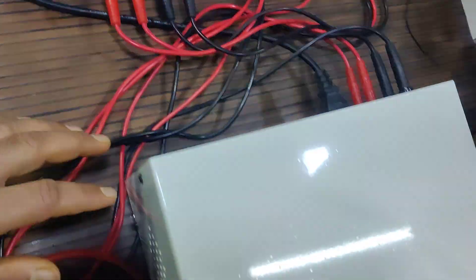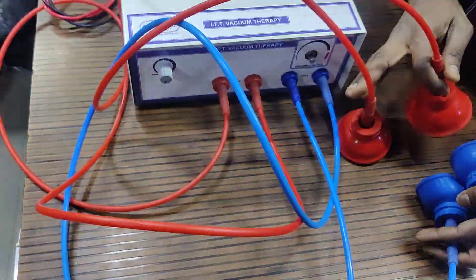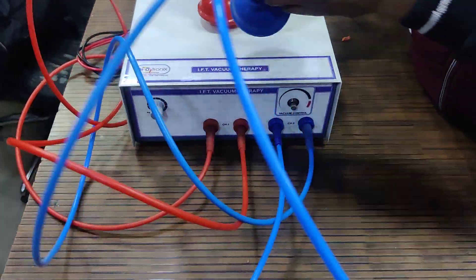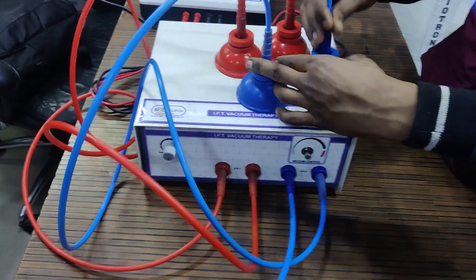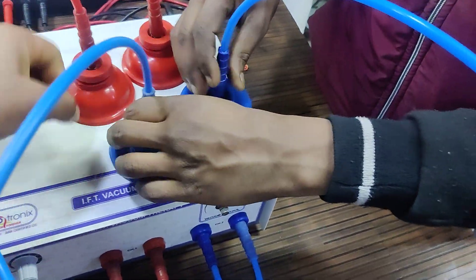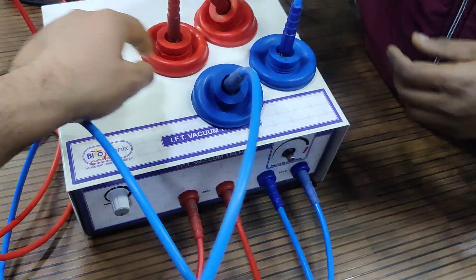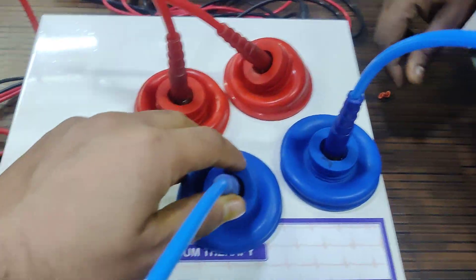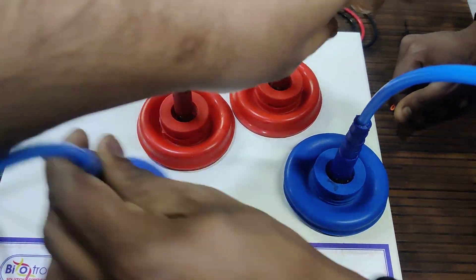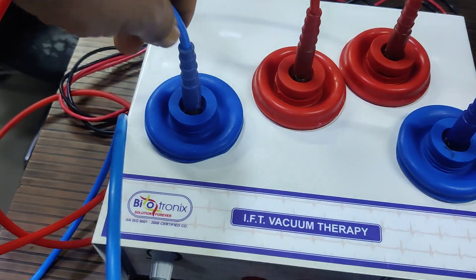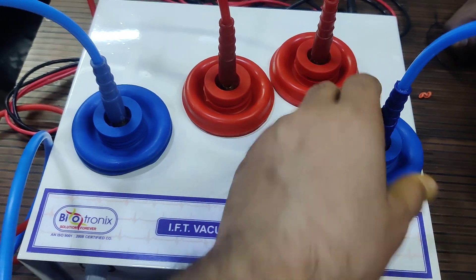Now I'm showing you the demo of the same. These are the four electrodes, vacuum electrodes. When I place them, you can see the vacuum. You can see that because of the vacuum, they have stuck to the surface.